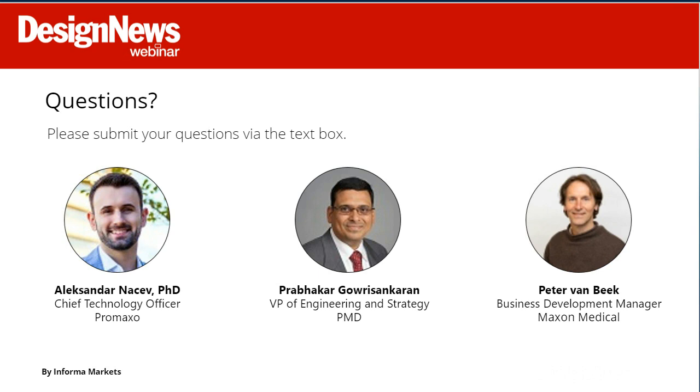So Peter and Robert were discussing this. It really comes back to trying to reach your target. And so you need to have feedback control. And we do that with respect to the MR imaging itself, where you can predict where your robot and your end effector is going, but then you actually need to image it and verify it and correct any errors that you have.